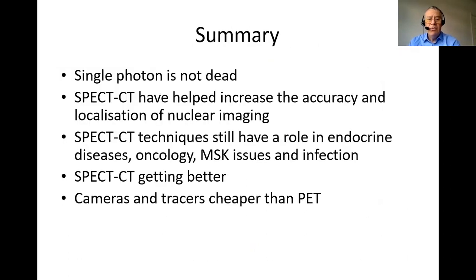So in summary, single photon is not dead. SPECT-CT helps to increase the accuracy and localization of imaging and has a role in endocrine, oncology, and MSK. SPECT-CT is getting better. And remember, the cameras and tracers, even those fancy multi-headed SPECT-CTs, are still cheaper than the PET-CT scanner. Thank you very much.